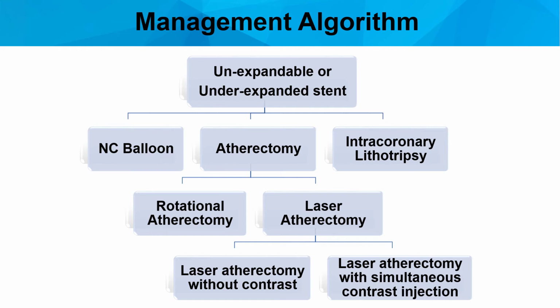You do want to watch out for burr entrapment, which can occur from the stent struts. And to minimize that potential risk of burr entrapment, we recommend starting with a small size burr and then increasing the burr size as appropriate. And when you start the rotational atherectomy, it's important to use slow, gradual pecking movements of that burr, and that helps avoid burr entrapment.